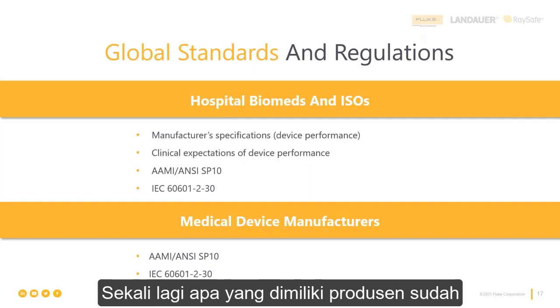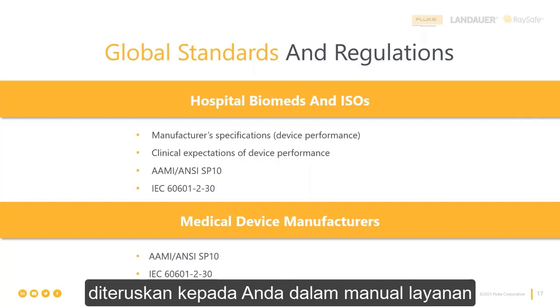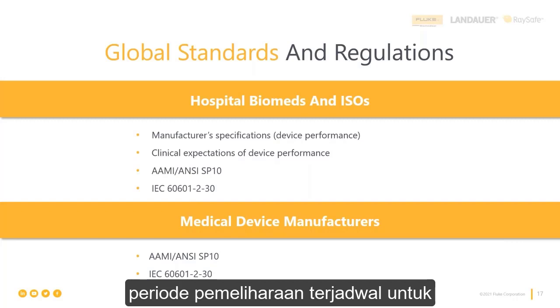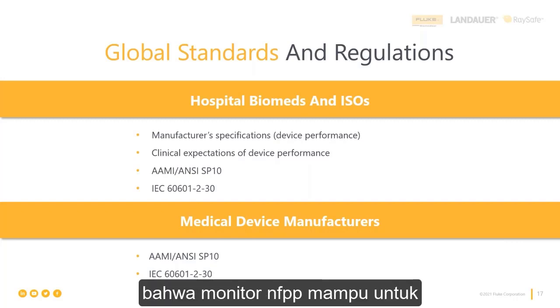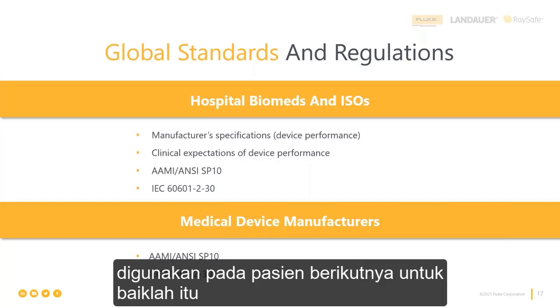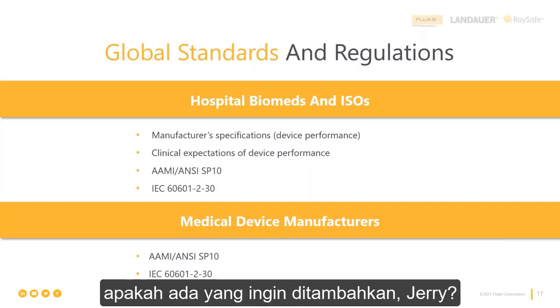So again, what the manufacturer has determined needs to be tested gets passed on to you in the service manual, and that is to be followed in a scheduled maintenance period to make sure that that NIBP monitor is able to be used on the next patient for either diagnosis or treatment. Anything to add there, Jerry?